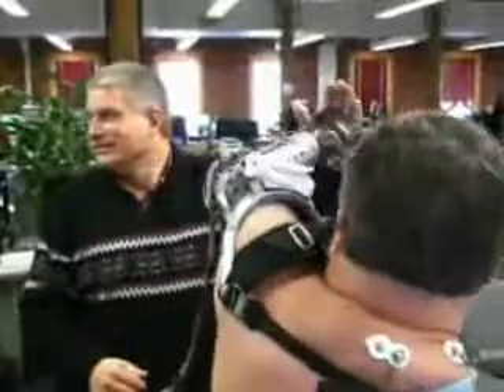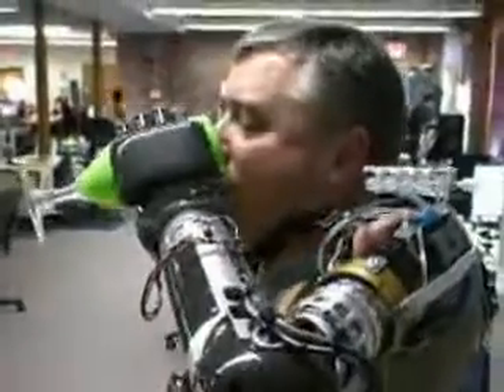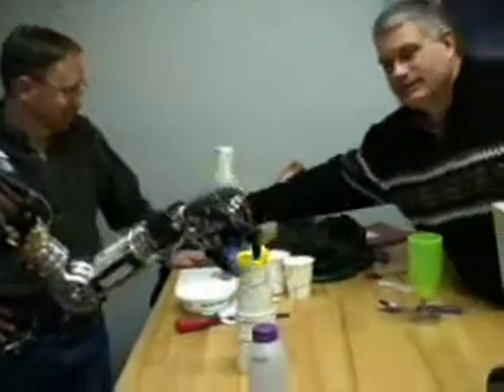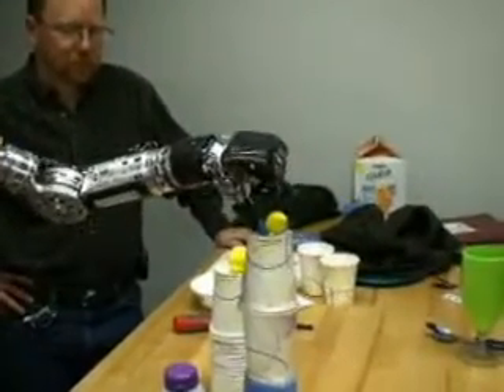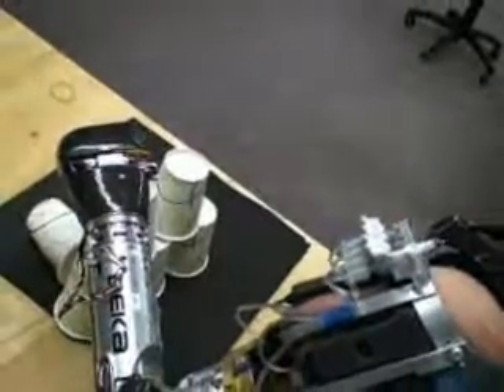The Luke arm also had to be agile enough to do exactly what the human arm can do. So far, the task pilots within a matter of 5 to 10 hours of practice can operate the arm such that they can pick up small objects or stack cups. They can eat grapes.